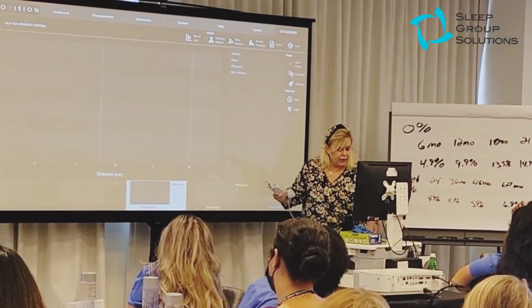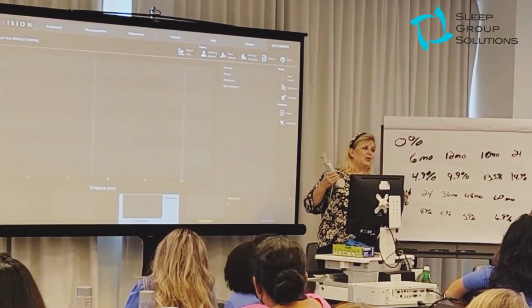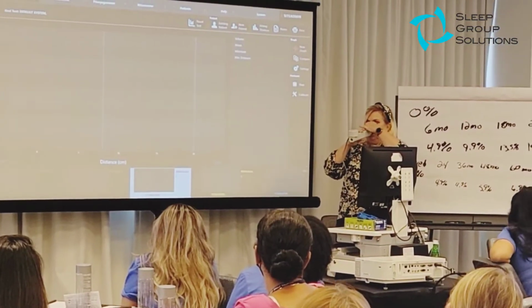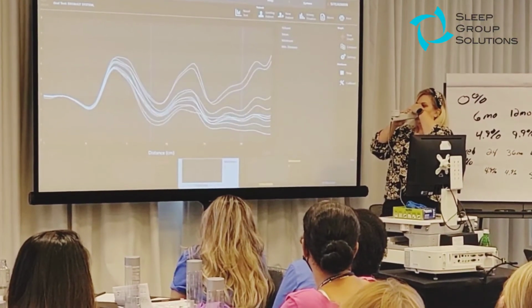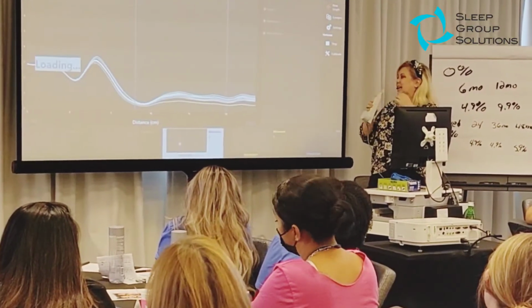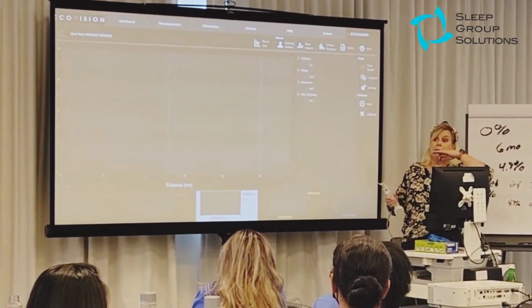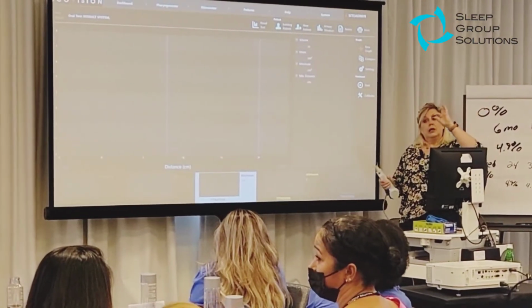So here you go. All right, so here's 6 millimeters vertical. My bite's already edge to edge. I'm an orthodontist nightmare. Okay, so edge to edge, I'm just gonna go straight up. 6 millimeters, okay? Okay, I didn't do anything. But if I were using a George gauge, which is the way we've made it before, that's where I would have started. The George gauge is 5 millimeters, this is 6. So 6 don't do anything.